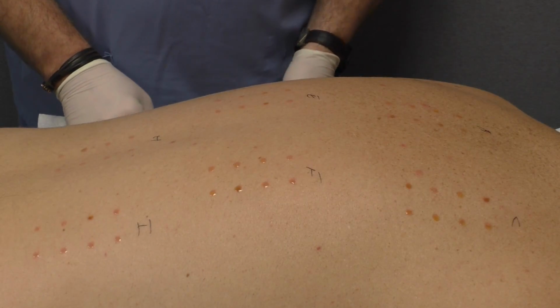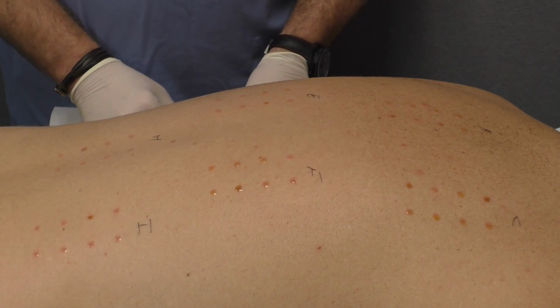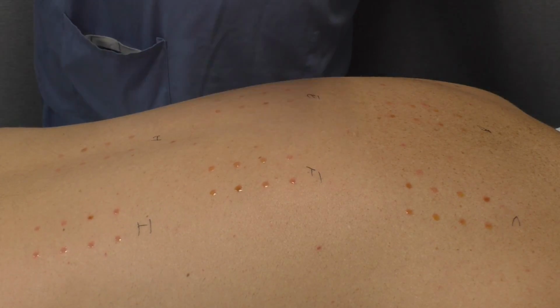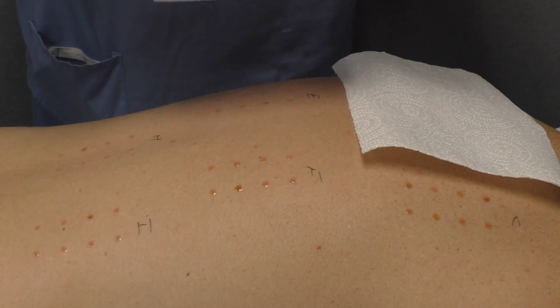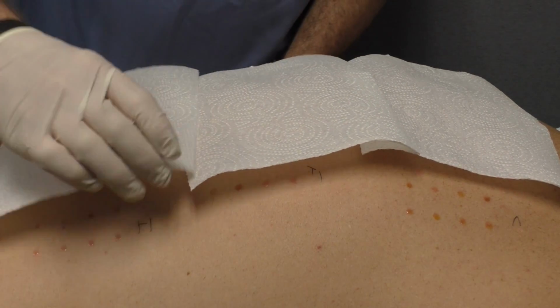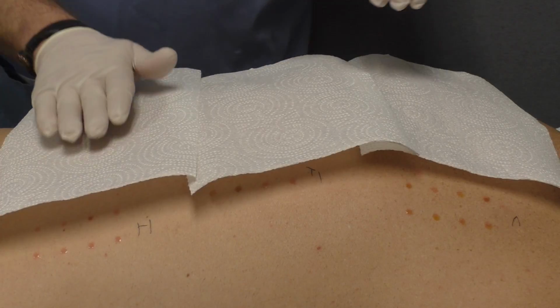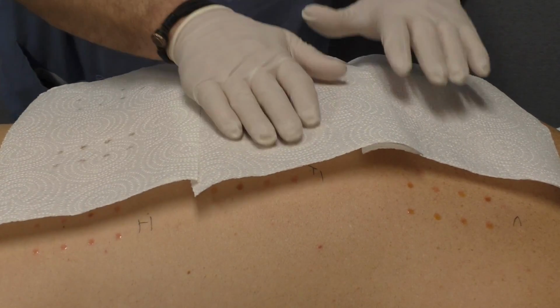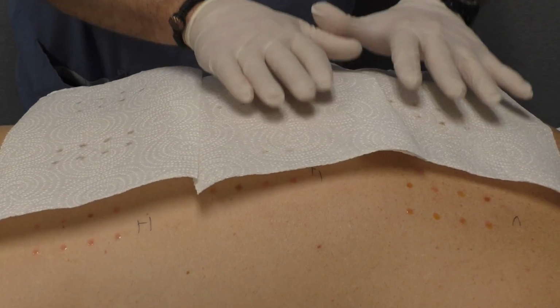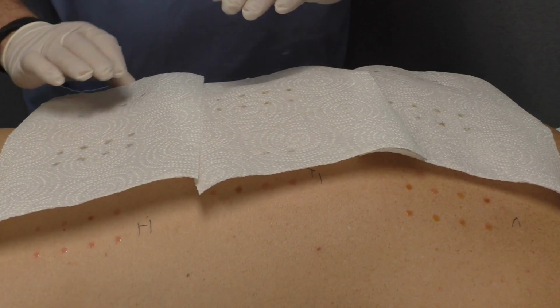Okay, 15 minutes have come and gone, and it's time to do the evaluation on the patient. The first thing I like to do is lay some paper towels down over the patient's back and just sort of blot away some of the excess allergen extracts. I'm careful not to smear or rub, but by blotting away some of the excess allergen extracts, this will make the evaluation much easier.